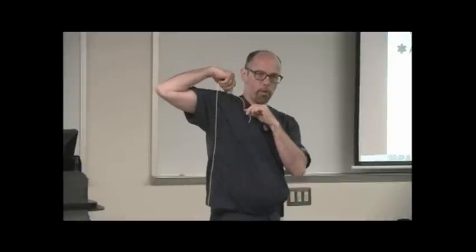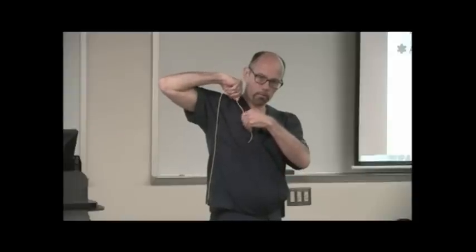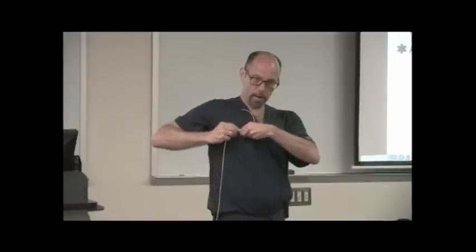But they designed this catheter that is placed through a short central venous line called an introducer. And it is advanced into the patient's first right atrium, right ventricle, through the tricuspid valve, out through the pulmonic valve into the pulmonary artery, and then when it's home, the distal tip of this is sitting in the pulmonary artery. Okay? So notice its shape. What does that look like? The right ventricle. And when it's placed, this shape helps it get in the right spot very easily.